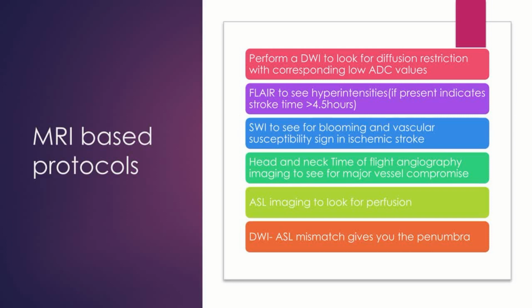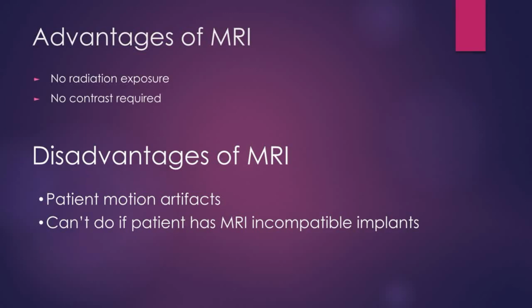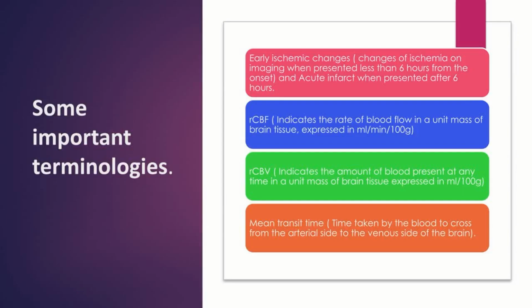6. DWI-ASL mismatch gives you the penumbra. Advantage of MRI is no radiation exposure and no contrast requirement. Disadvantage is motion artifacts.